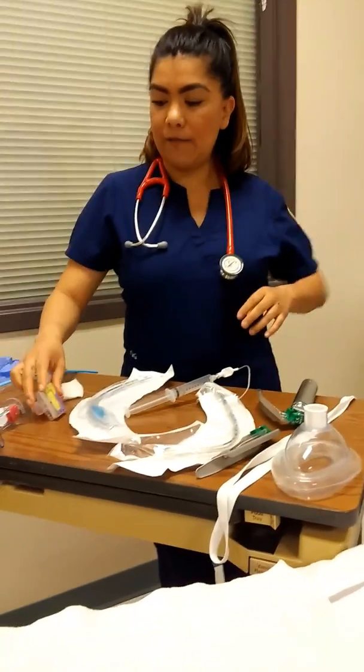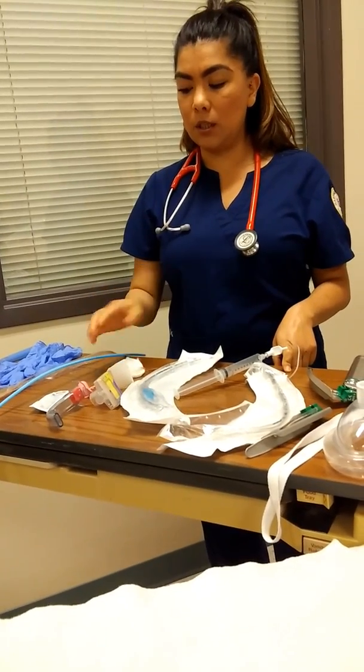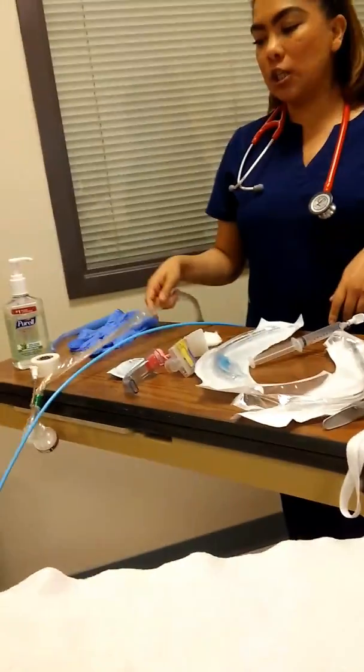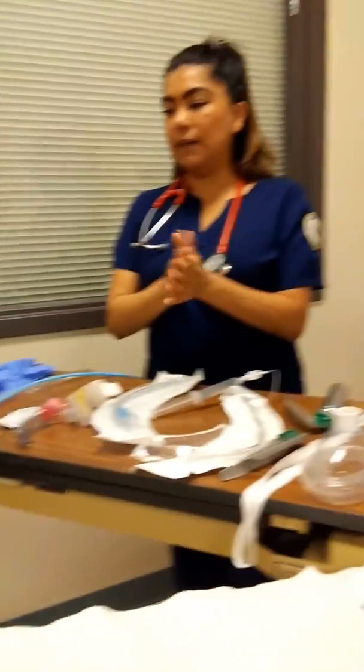We want to have our CO2 detector, our OPA, our bite block. We want some gauze, our bougie, our suctioning tube, our Yankauer, our gloves, and 3 mLs of hand sanitizer.